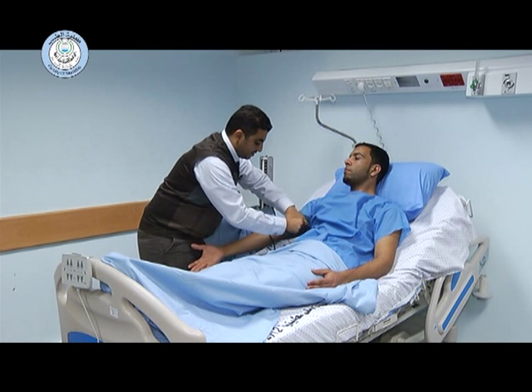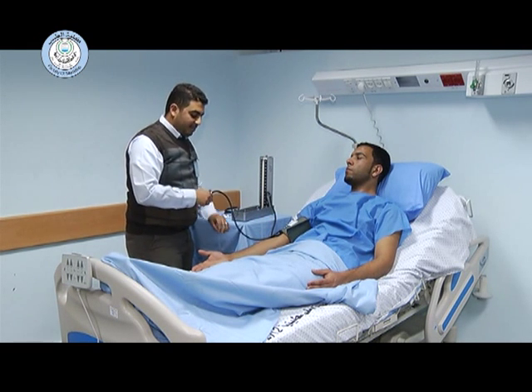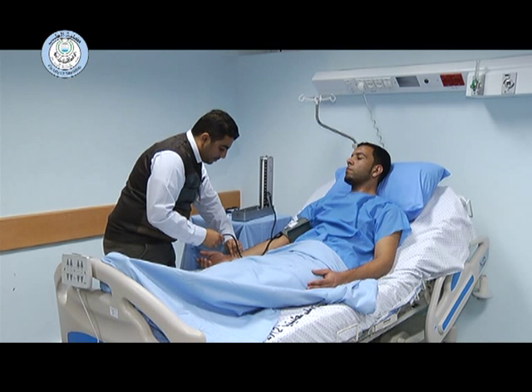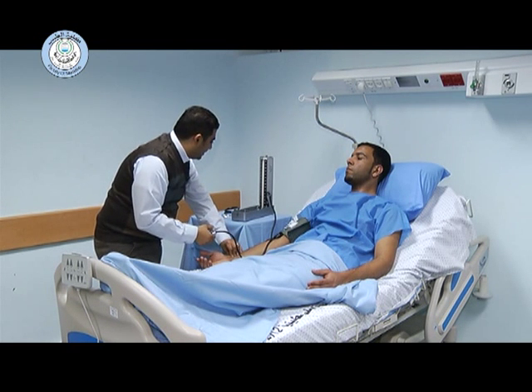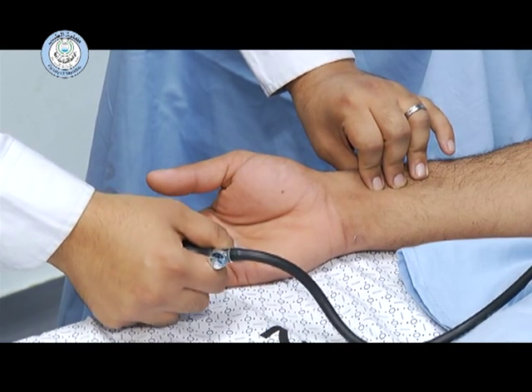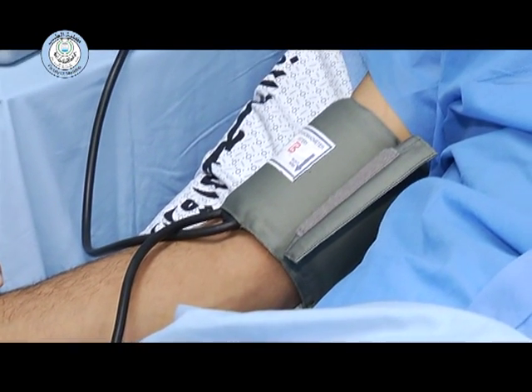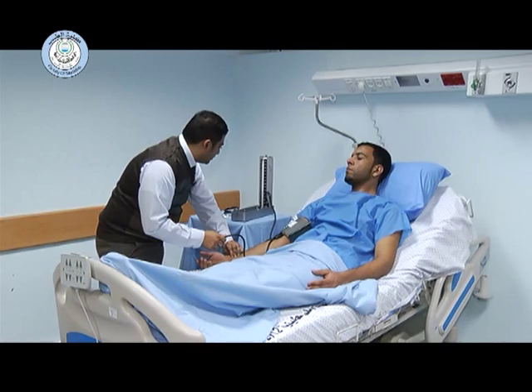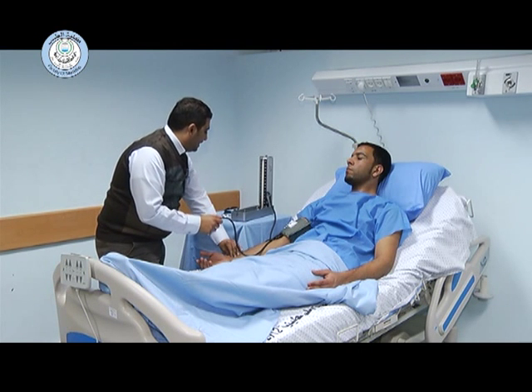We place the cuff 2.5 cm above the antecubital fossa and begin the examination using the palpatory method. We inflate the cuff until the disappearance of the radial artery pulsation. By the palpatory method, we ensure the cuff is not over-inflated and that the patient is comfortable.